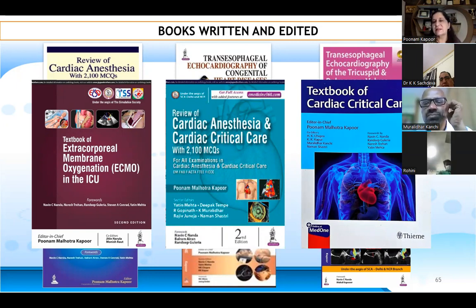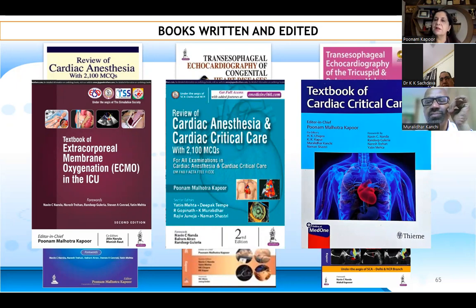So I found this distinction of transthoracic much better than a transesophageal, where we can't advance the probe beyond the gastric stomach in a descending thoracic view. A subcostal or a suprasternal view is very good to see the descending thoracic aorta and tell us the difference between a pleural and a pericardial fluid.